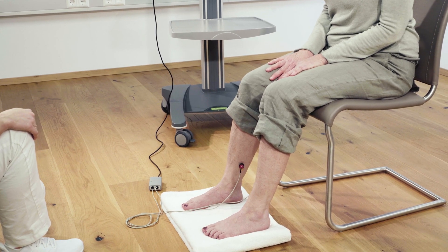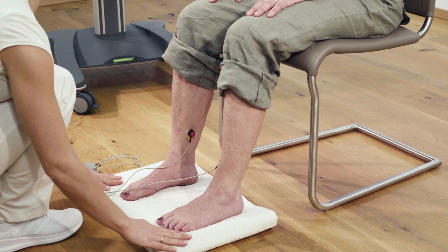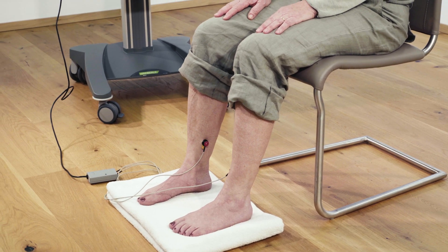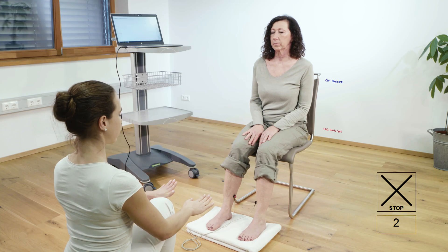The angle between thigh and lower leg should be about 110 degrees, so the leg should be slightly stretched forward. After the calibration process is completed, the recording of the sensor signal starts automatically.